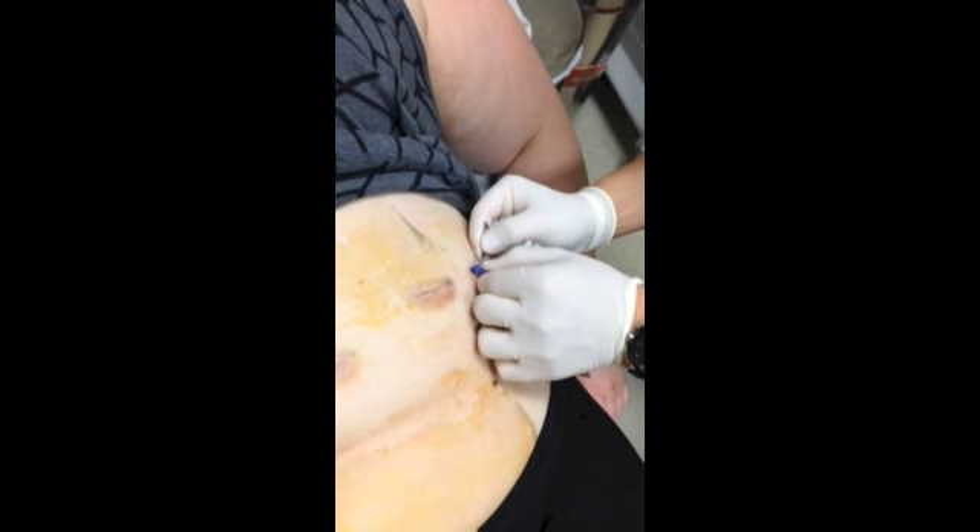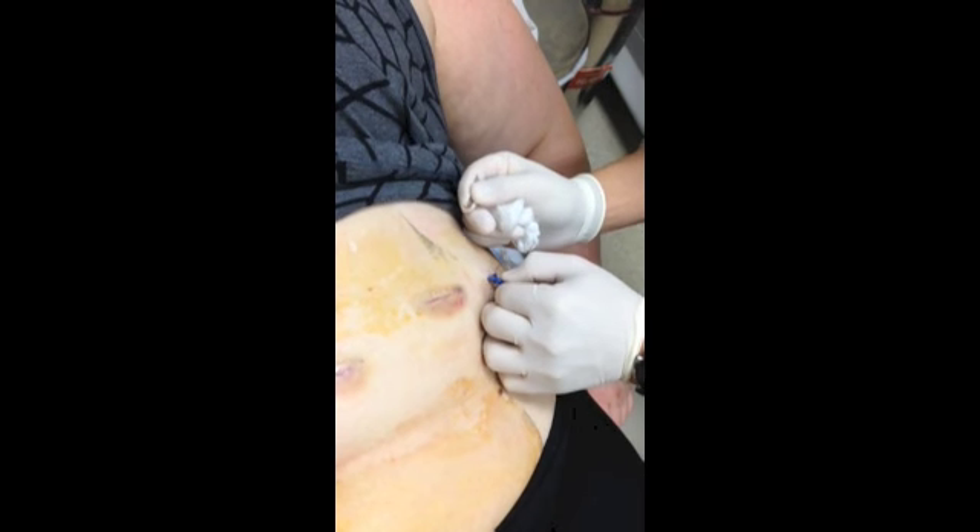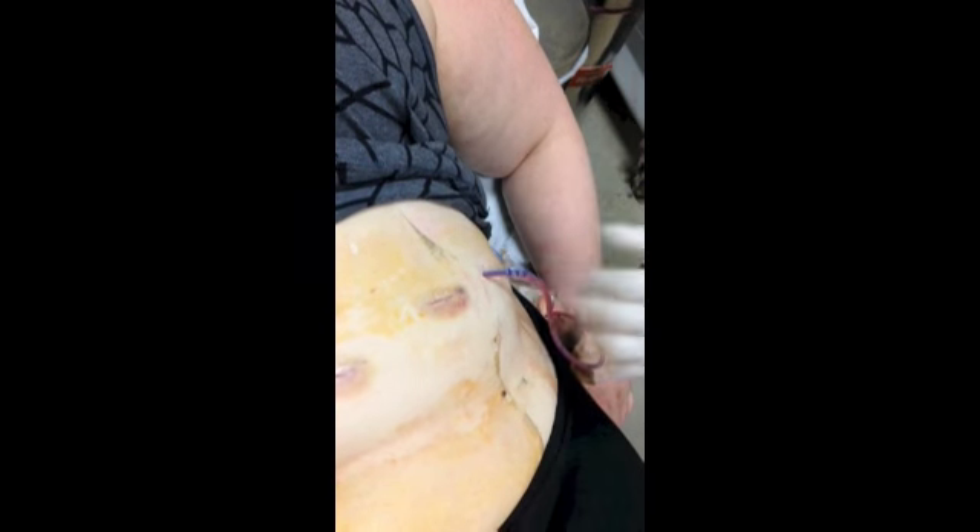So I'm going to remove the stitch first — a little bit of pull in here — and the stitch is out.